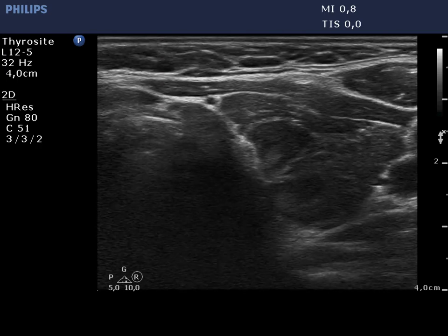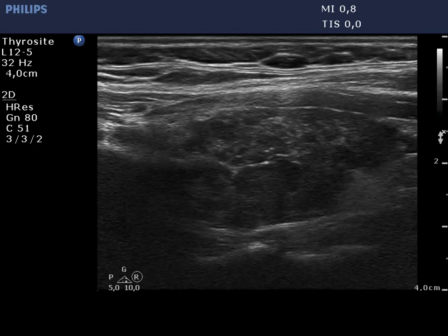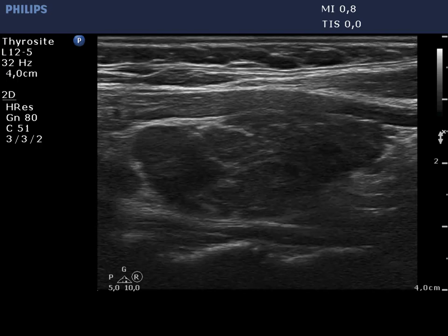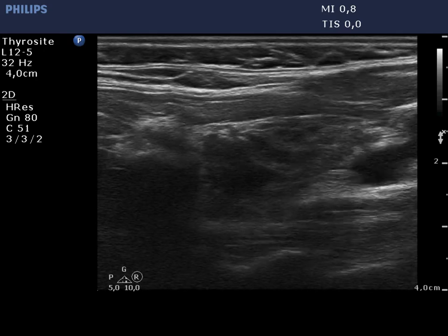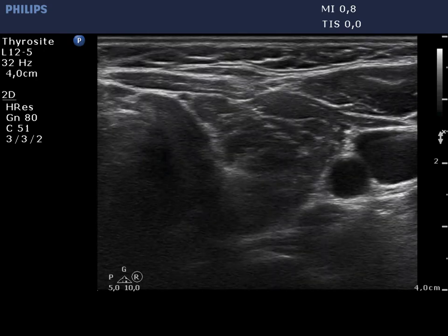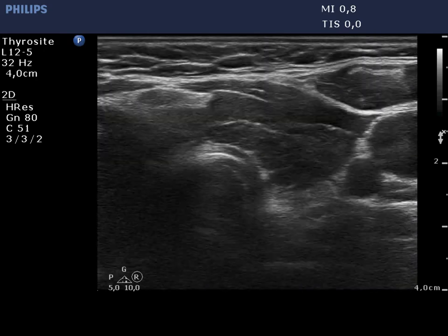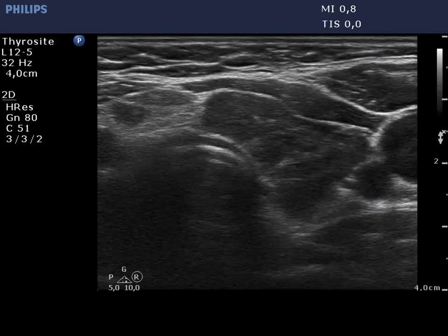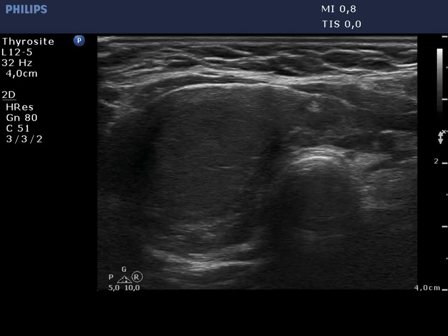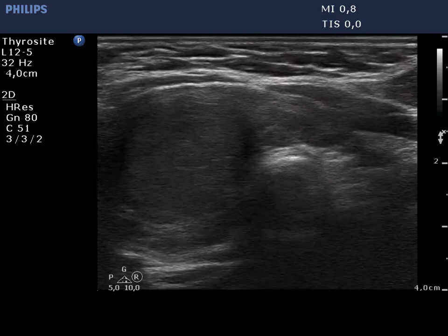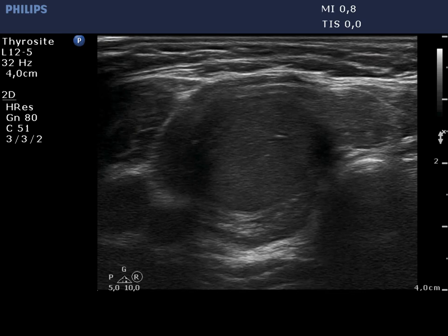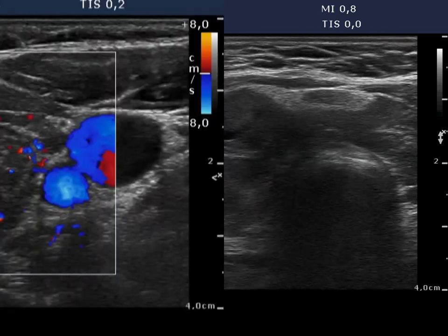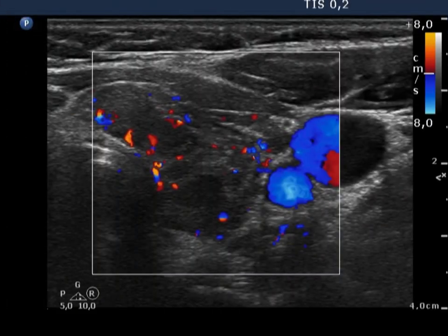At first, the left thyroid is seen, which presents the typical pattern of an autoimmune thyroid disease. The thyroid is hypoechoic, inhomogeneous, and consists of multiple hypoechoic areas divided by fibrous tissue. The vascularization is average, corresponding to the actual euthyroidism on thyrostatics.